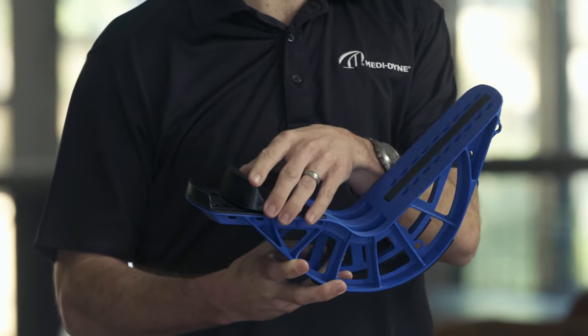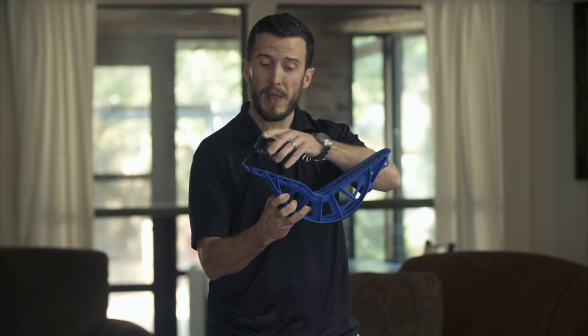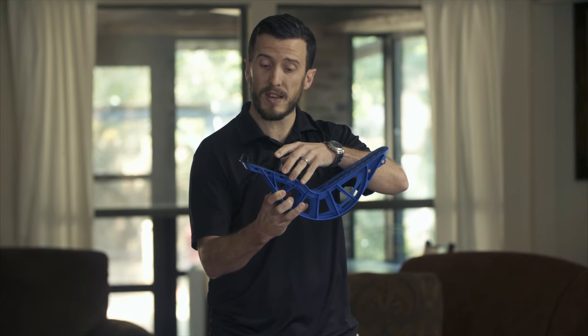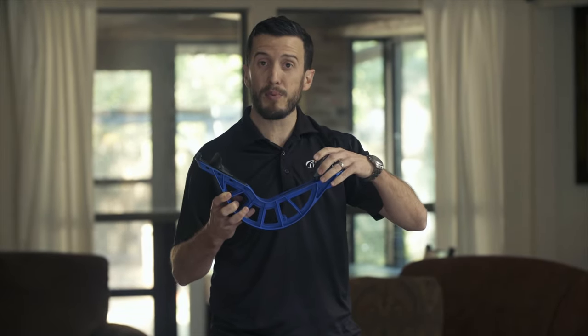It has an adjustable heel plate that you can slide backward to decrease the intensity of the stretch, or slide forward to increase the intensity of the stretch. It also comes with a toe lift, which gives you an advanced plantar fascia stretch — great for a common problem called plantar fasciitis.